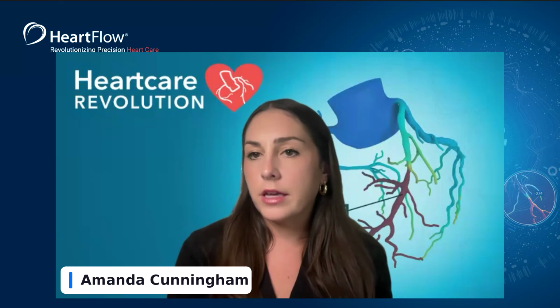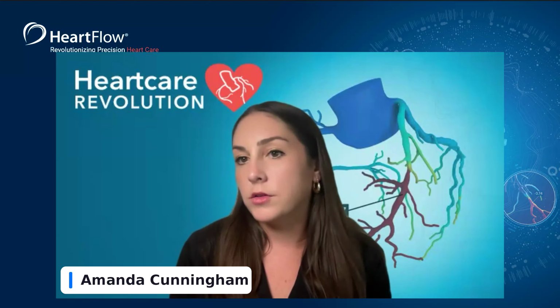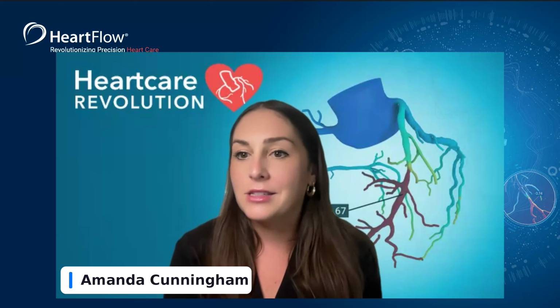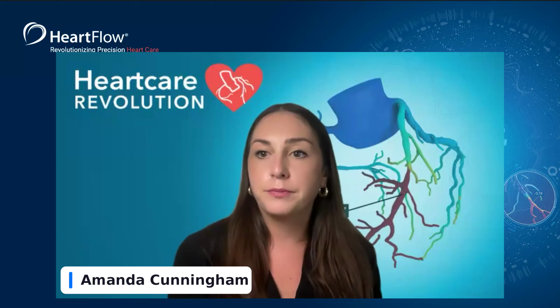One for you, Amanda, it says, can we use a central line? So what do you think about that one? Yes, as long as, typically on the end of the IV catheter, it will say power injectable. So it's very important to make sure that it is a power injectable. It'll say 5 to 7 mLs rated, and also make sure you test it, you know where it was placed, and that it's clean and appropriate. So yes.